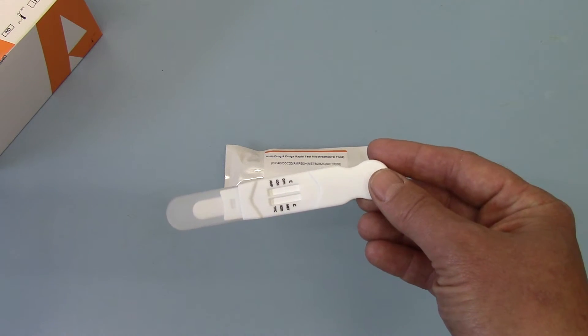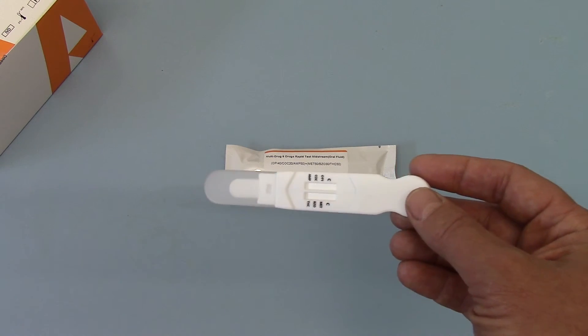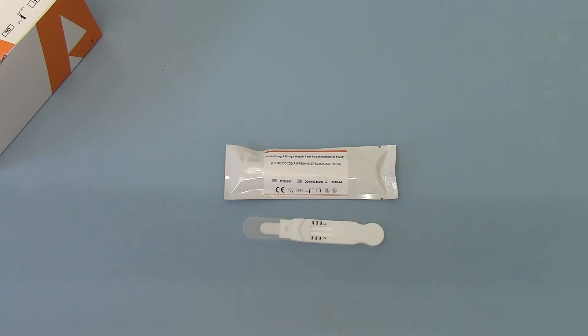There are no chain of custody issues with the sample not coming from the individual you're looking to screen. The only safety precautions to put in place are the same as with any other saliva test: no drinking for 10 to 20 minutes and no smoking for 10 to 20 minutes before sampling, and nothing else in the mouth at that time. So what we're going to do now is absorb some saliva onto it and show you the ease of reading the results in part two.